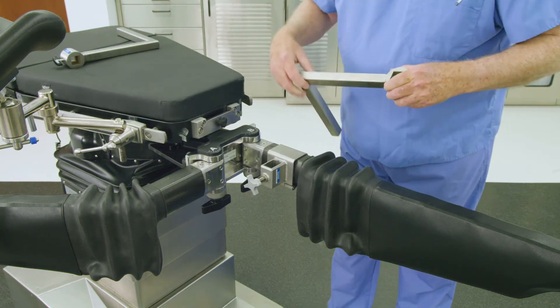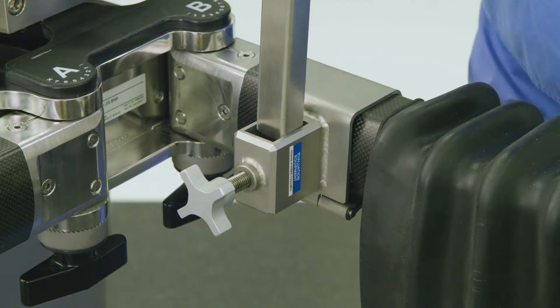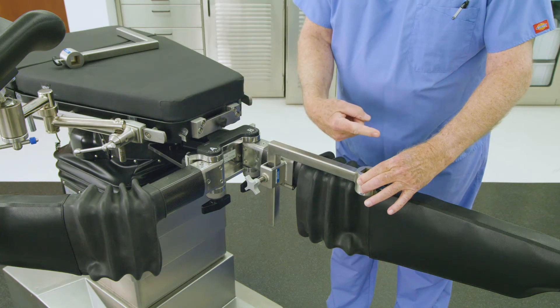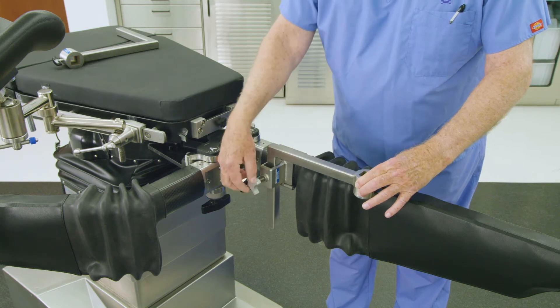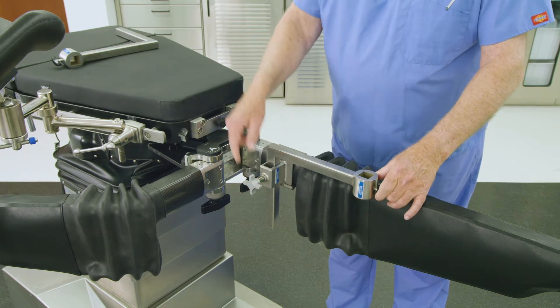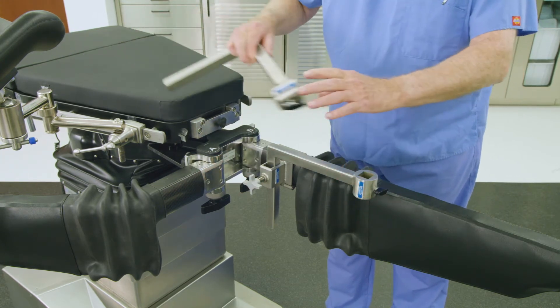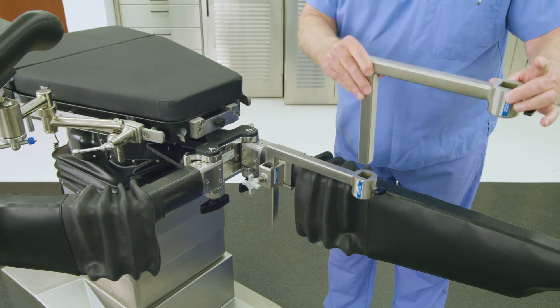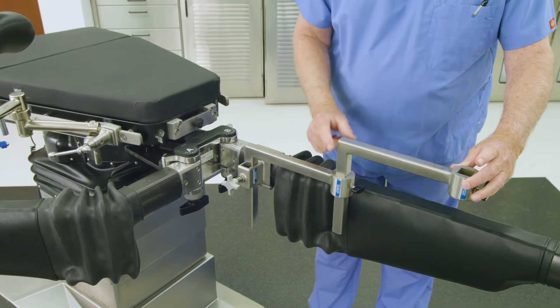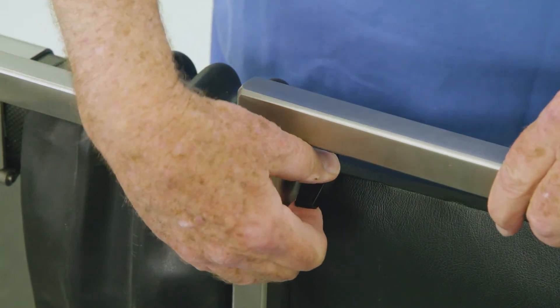Insert the L-shaped extension device into the accessory spar clamp's hole so that the extension is pointing away from the patient's body and toward the distal end of the leg. Tighten the knob to secure. In some cases, especially those at the distal end of the tibia near the ankle, a second L-shaped extension may be needed. Repeat the previous instructions to add a second L-shaped extension in series with the existing one.